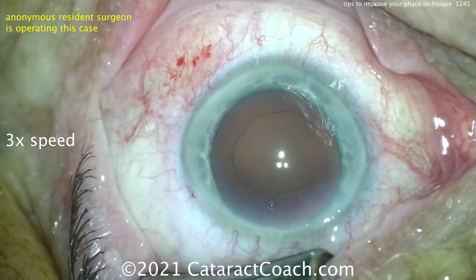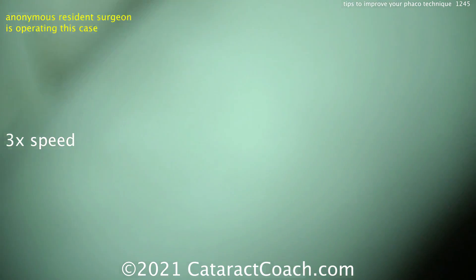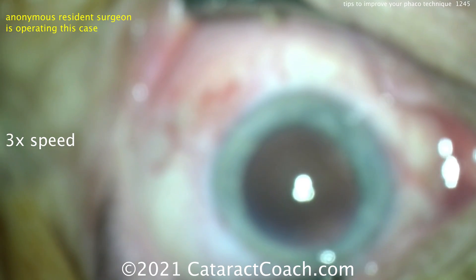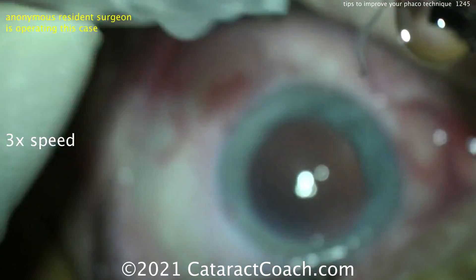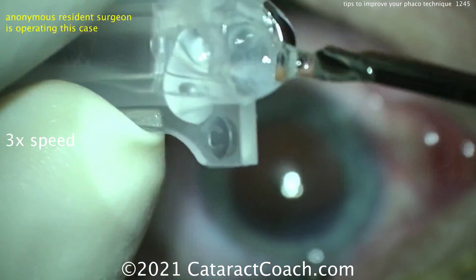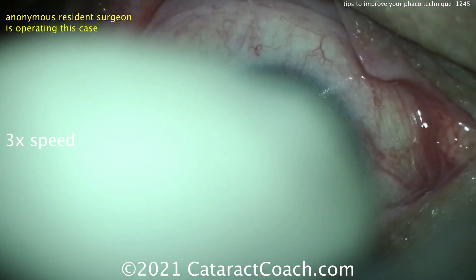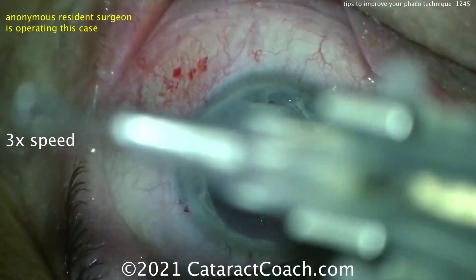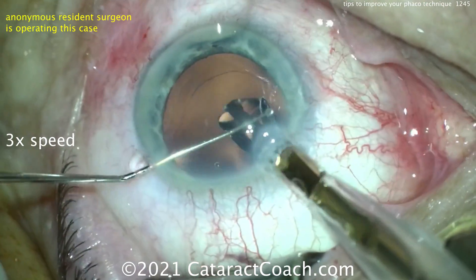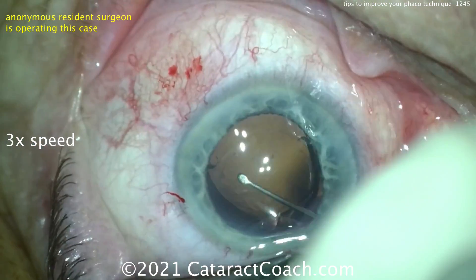Let's fill up the capsular bag — oh good, you're going to load it yourself. I agree — I like residents to load their own lenses. Looks like a single-piece acrylic lens going into the injector, and that's going in the correct orientation — looking good. Looks like an Alcon SA-series lens; let's get this thing delivered inside the eye.